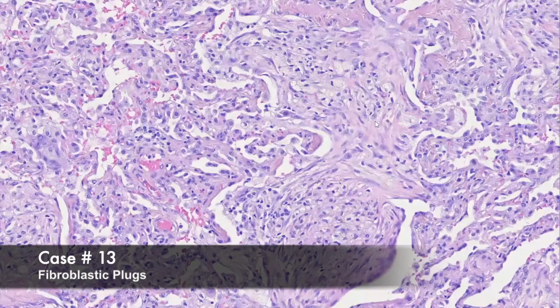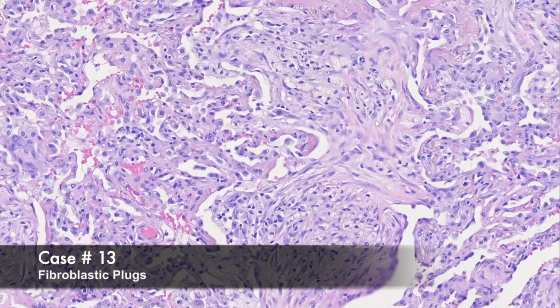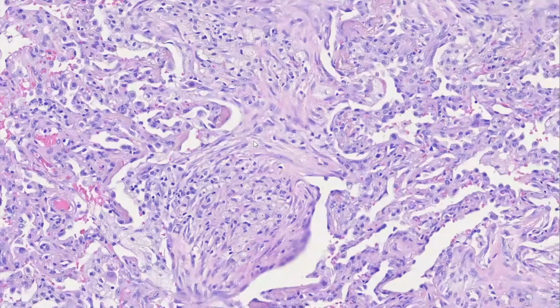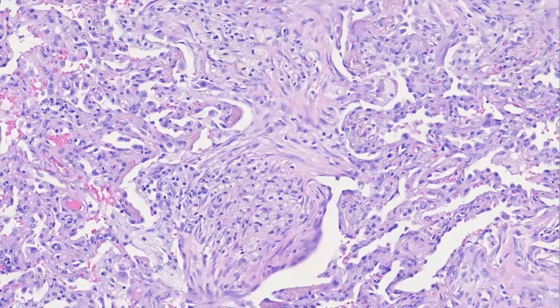And so an important distinction is we don't call these fibroblastic foci. We reserve that term for usual interstitial pneumonia. While these are focal areas of fibroblast proliferation, we instead refer to these as fibroblastic plugs. And they tend to have this polypoid look to them.